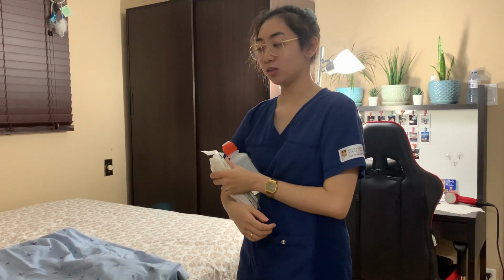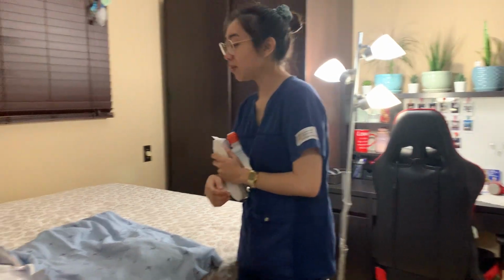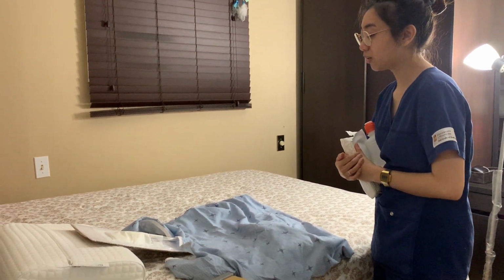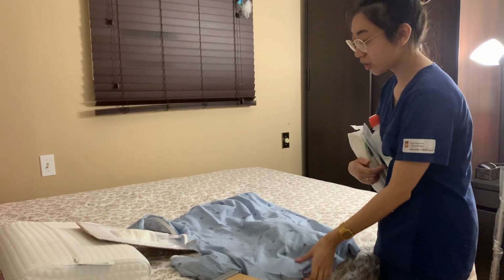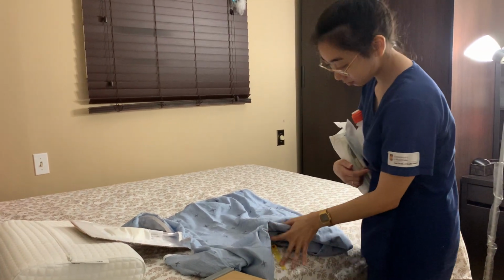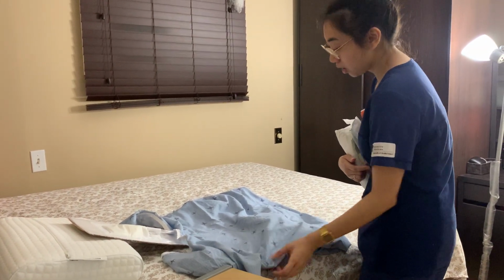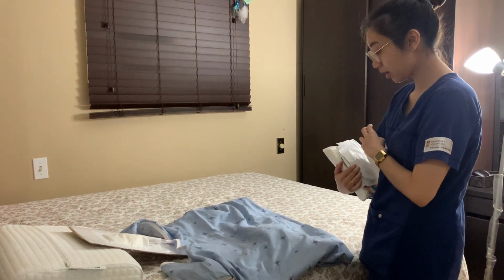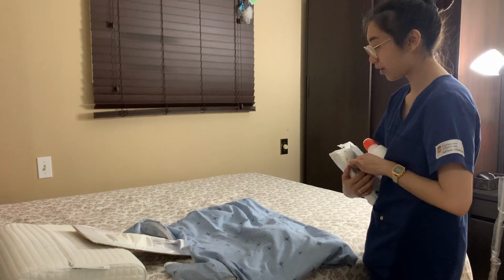And now I'm going to introduce myself to my patient. Hi, Miss Linda. My name is Kamilah. I'm a student nurse, and today I'm going to be changing your chest tube dressing. So I'm just going to check your armband here. Okay. Could you please state your first and last name, your birthday, and do you have any allergies?